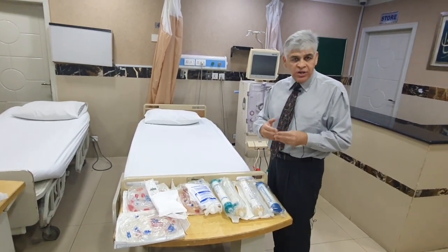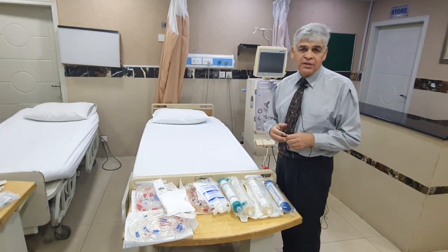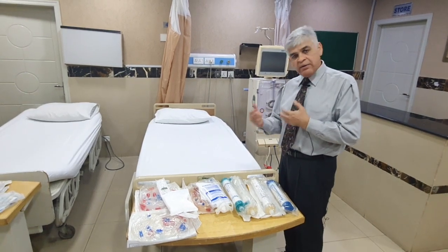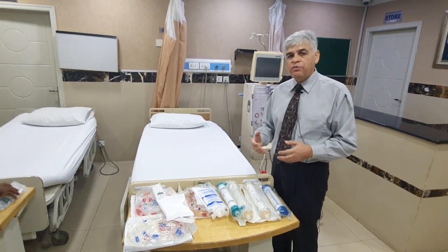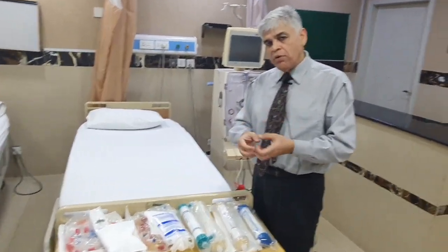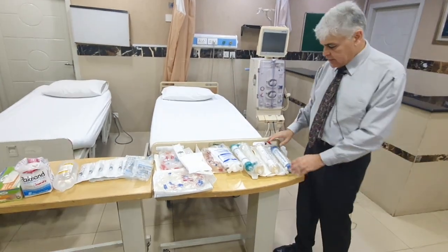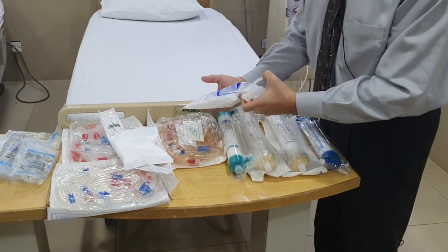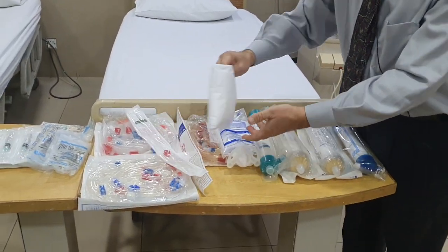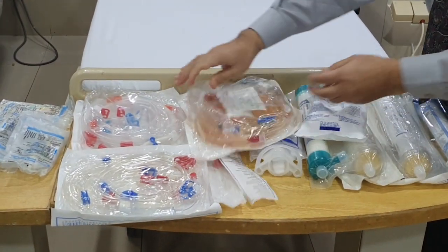So for instance, if there is a younger patient who's got small blood vessels, you wouldn't use a very large needle, because in that way you can counterpuncture that vascular access, and so on and so forth. But if there is a large patient, you won't use a smaller needle, because then you won't get the desired blood flow which you need, because the bore of the needle is important when you're dialyzing. So you need to take all of those things into consideration. Here I've got the different dialyzers which we use, also called the filters. Here I've got the bicarbonate solution, and I'm going to talk to you about that in a minute. Here we've got the fistula needles, and then we've got the different blood tubing lines.